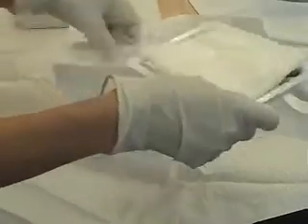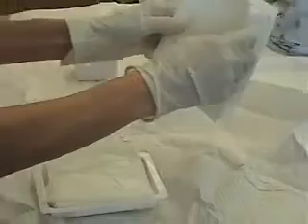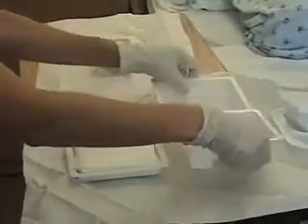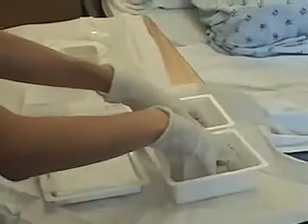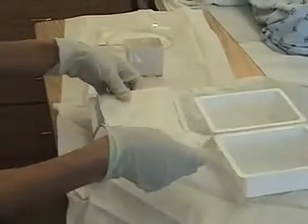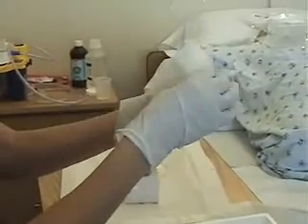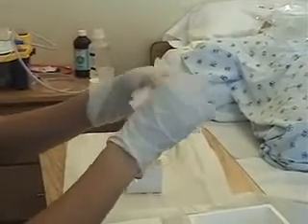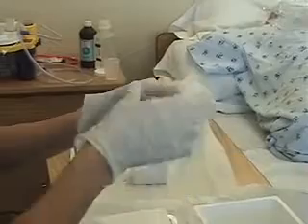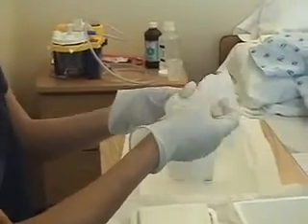Then you come here, prepare your cleaning kit. There are two containers you're going to be using, and I am planning to put peroxide and the saline in here. And of course, I am going to use my sterile gloves. Look at this. Who can put sterile gloves on like this? You want to prepare, make sure they're all ready to go. Seriously.